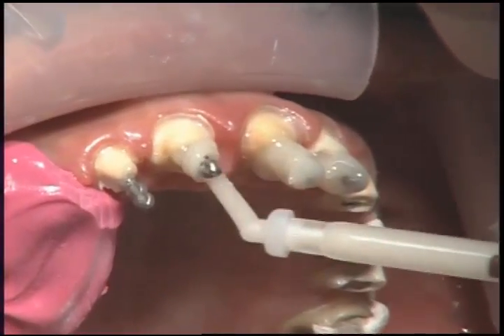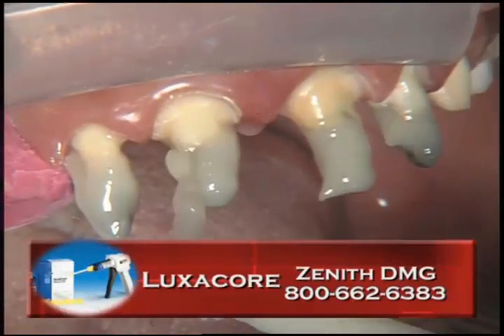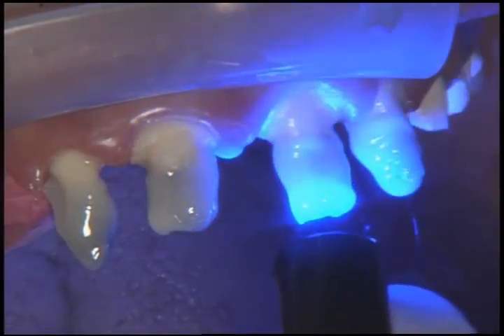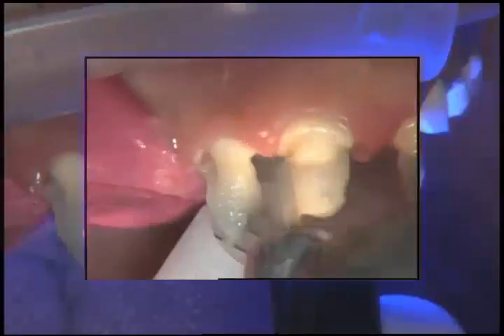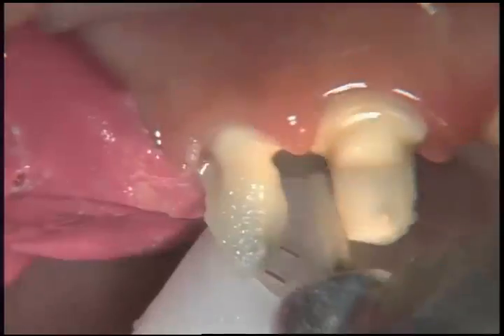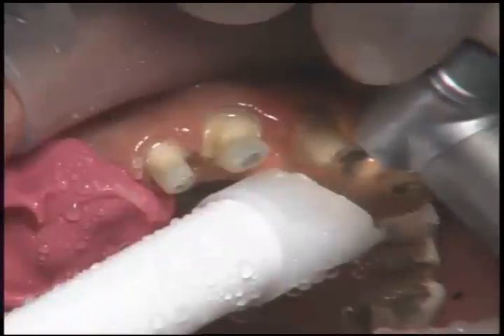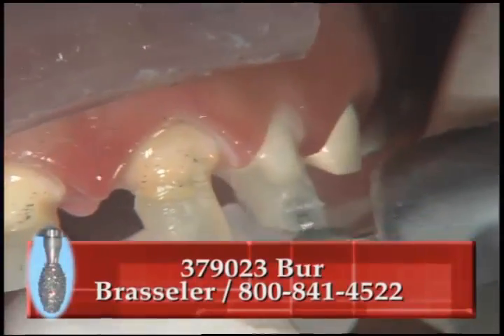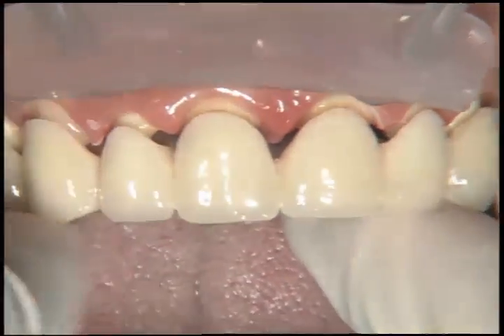And then we will begin our composite buildup. This happens to be Luxicore. There are several anatomic forms available that you may want to use in a case like this, where you fill the form and put it over the post. In this case I'm just going to freehand it — kind of like soft serve ice cream, going around and adding some layers. You want to put too much buildup rather than not enough. Cure it into place, and if you've used a nice high-strength dense buildup material, you can see some sparking coming from the football diamond as I cut away part of the head of the titanium post — that's part of what happens when you're working with titanium.